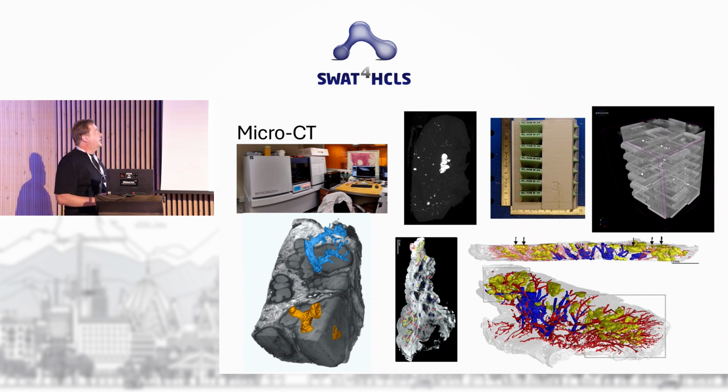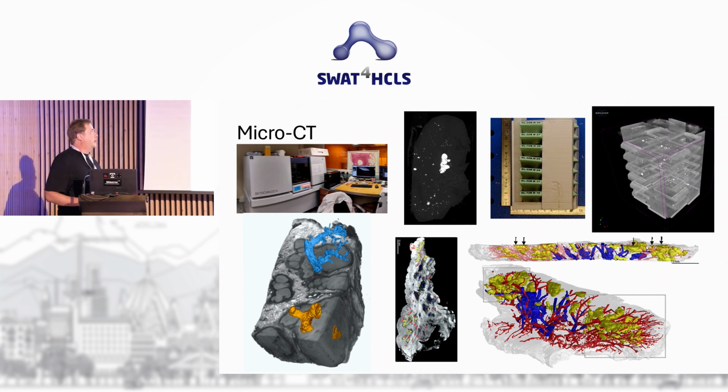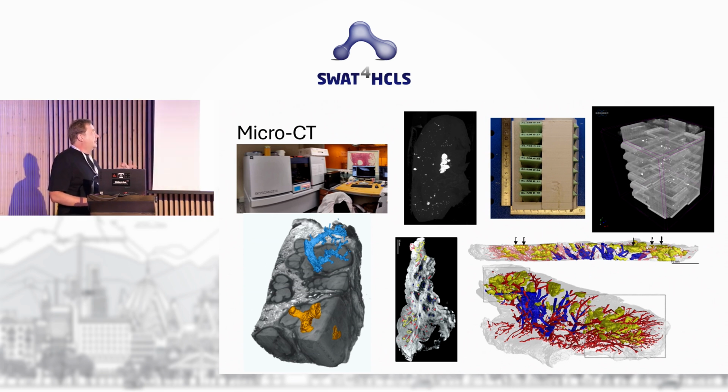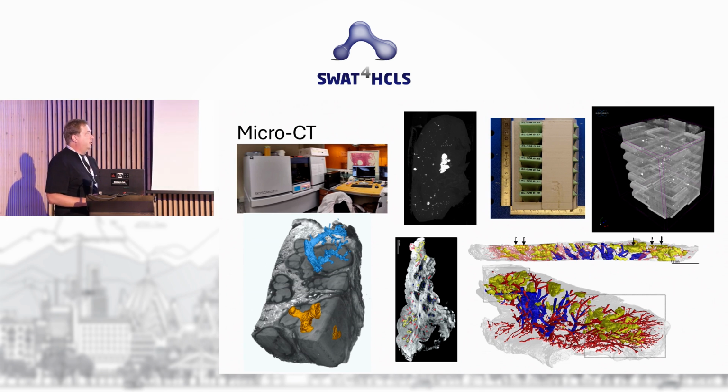We also can stack the blocks in this 3D printed holder, and these bright spots are the calcifications. And this helps us decide, okay, which block do we actually want to cut? How far do we want to go down? And sometimes we can see intermediate opacities that correlate to other lesions within the TB.